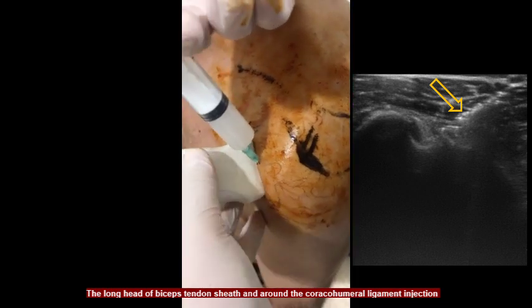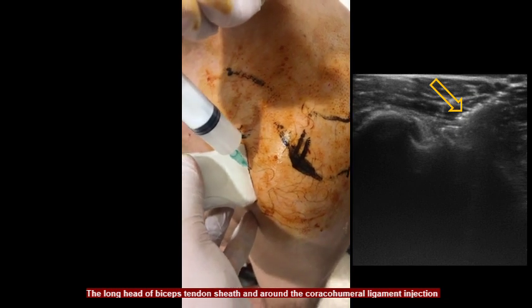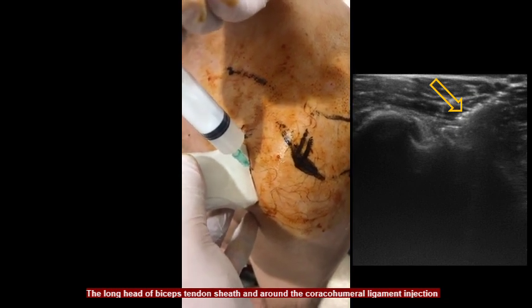And finally, 10 ml of the drug combination is applied to the long head of the biceps tendon sheath and around the coracohumeral ligament.